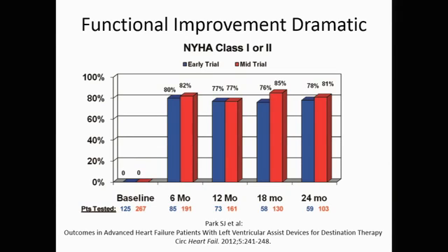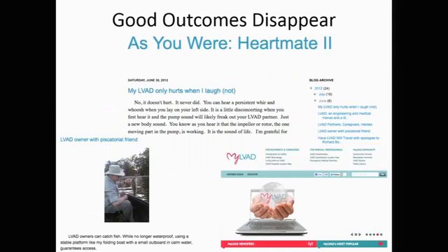That's important because when we talk with these patients preoperatively now, they get a palliative care consult. And we talk with them about what their goals for getting the device are. And most of them will say, by the way, when I stop getting this functional benefit, turn off the device and let me go. And so with many of these patients, if they have a devastating complication, when they reach the end of their time, their families, everybody understands, here's the criteria we created, it's time to stop. It's very nice, it's very important.